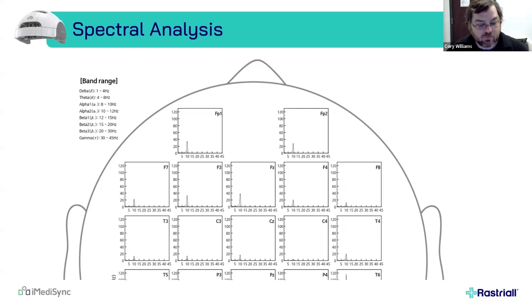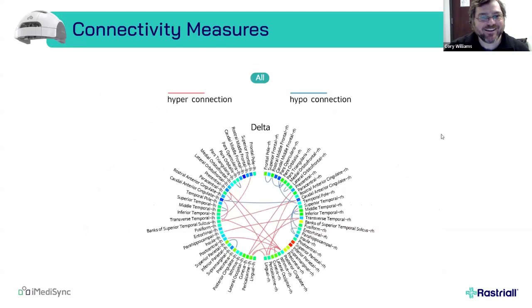And when we're able to combine that with our knowledge about a client, okay, so this could be an OCD profile or a depression profile. Well, we know that this person doesn't have OCD. Great, let's ask them some mood questions, because that might be a depression marker. Also, we'll see that the alpha is a little bit higher in the left hemisphere at FP1 and F3. So that's the area that we would target with TMS, that left dorsolateral prefrontal cortex. I would guess that this is probably a depression case, if I had to guess.